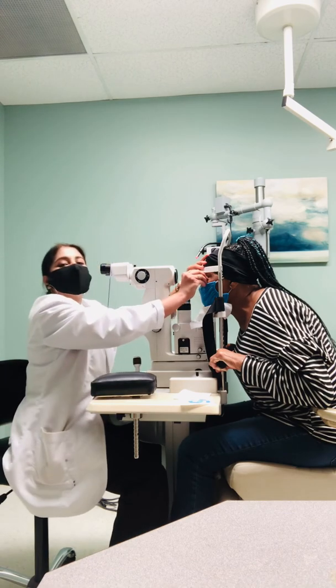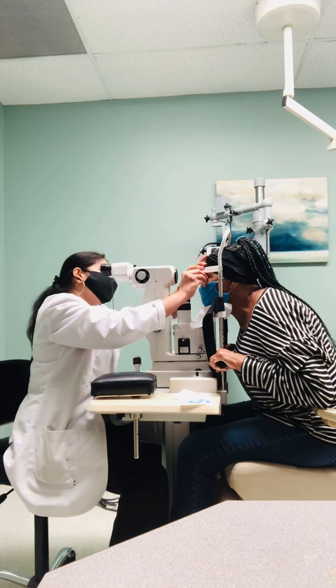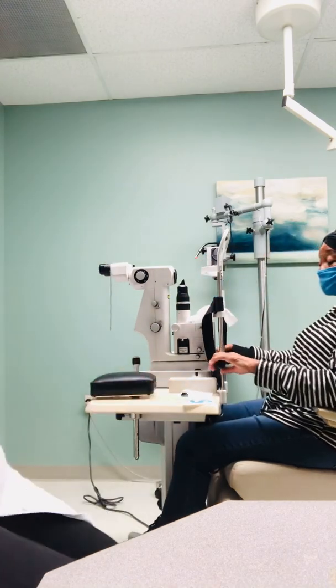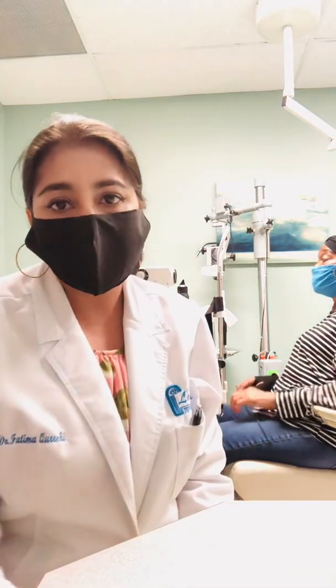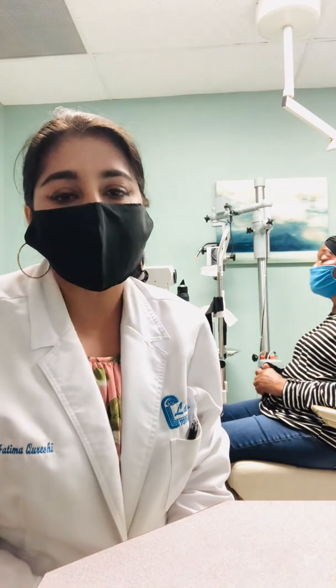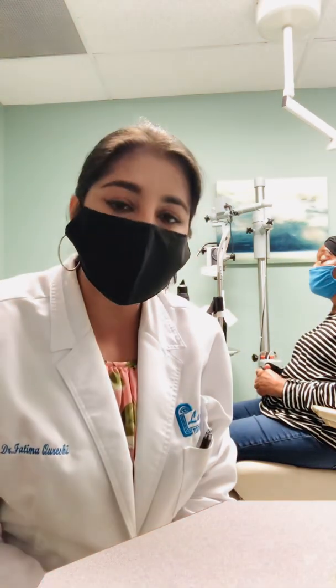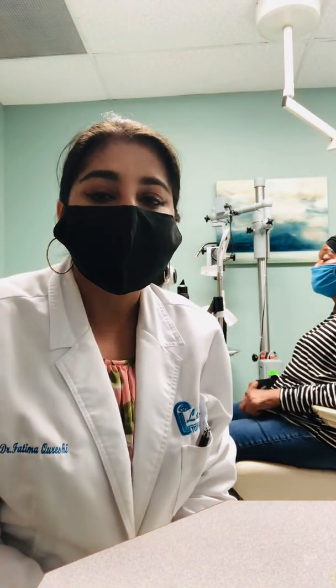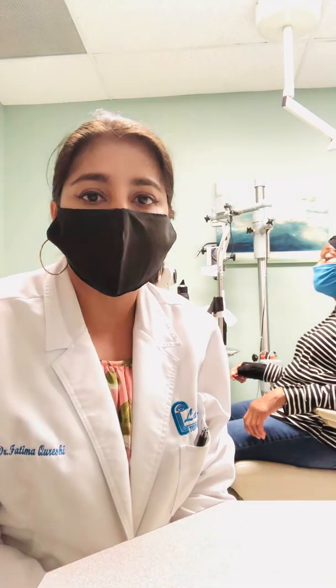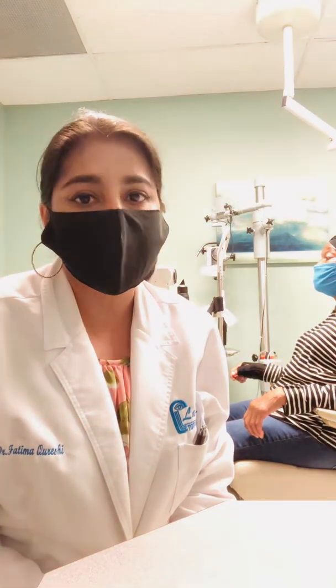Now I'm going to take out the lens from her eyes — and that's it, you can sit back. That was the procedure. As you can see, it is painless and very effective, so I highly recommend it for patients who have narrow angle glaucoma. We're going to send her home with a corticosteroid drop that she's going to use four times a day for about a week. Then I'll see her back and we'll check her pressure.